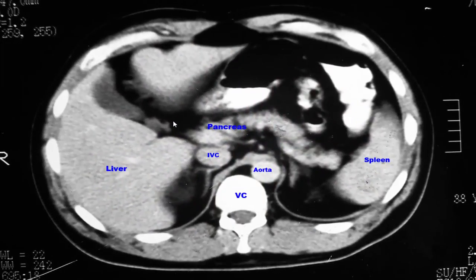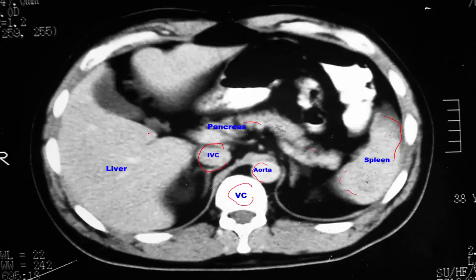In CT of the abdomen, we can find the spleen, here the spleen, this is the pancreas — body of the pancreas — and this is the aorta, inferior vena cava, and vertebral column. This is the liver, occupying the right side.